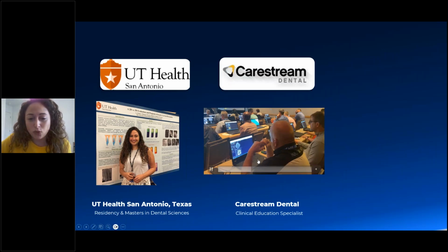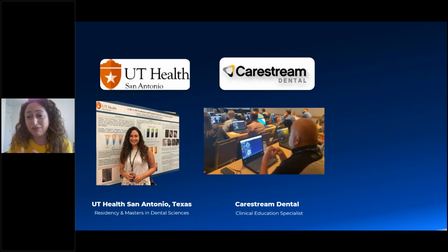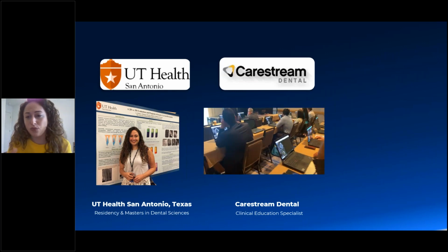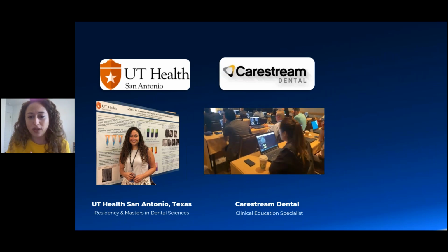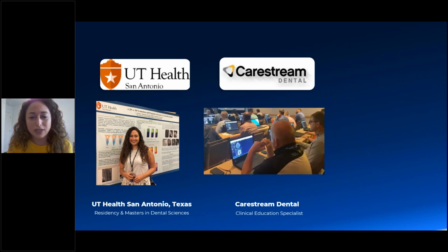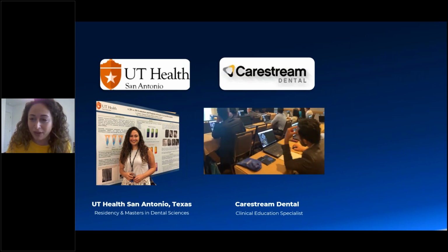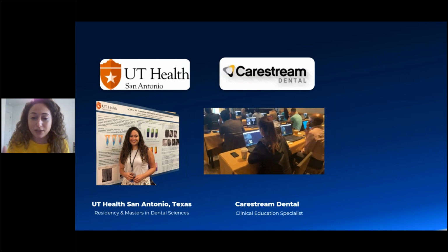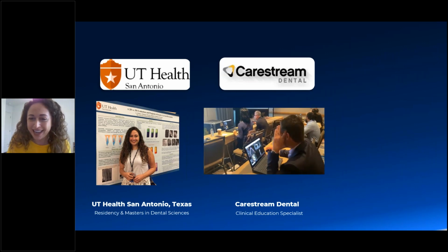After graduation, I joined Carestream Dental, and one of my main responsibilities at Carestream is really to make sure your questions are being answered. We would do this through one-on-one sessions, through webinars just like this one, CE, study clubs, and hands-on interpretation sessions, just like the video you're seeing here. Honestly, these are my favorites. We would be a group of people going through the same cases together from morning until the afternoon, a whole day just looking at CBCT scans.